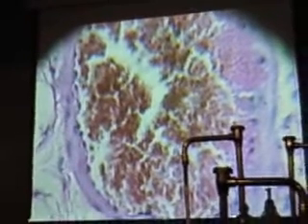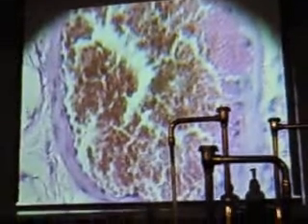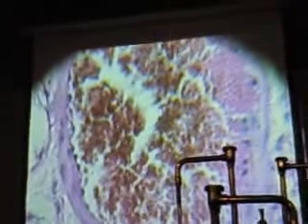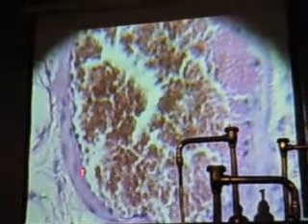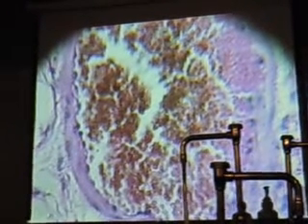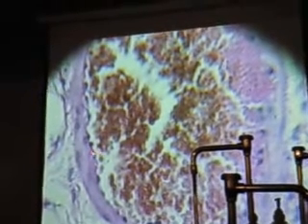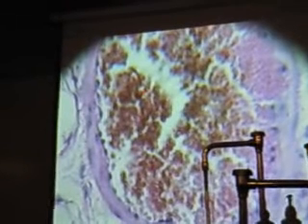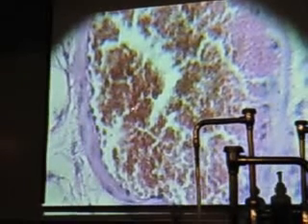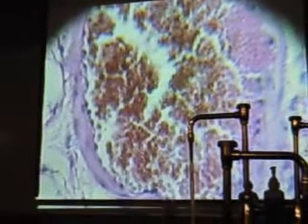Okay. Now, the trachea, if you've ever seen neck surgery, it's a bloody mess. Consequently, what's the cell type here? Squamous. Cell arrangement? Simple. What's another word for simple squamous in this organ? Endothelium, because what are all these? Red blood cells. Now, there are blood vessels all the way through here.